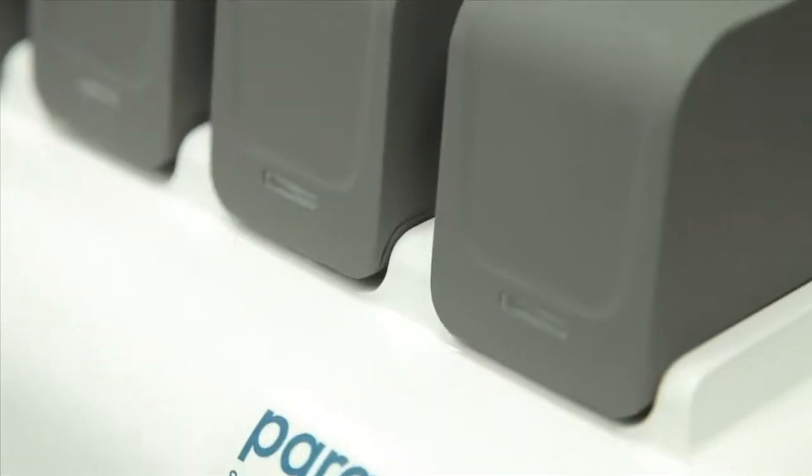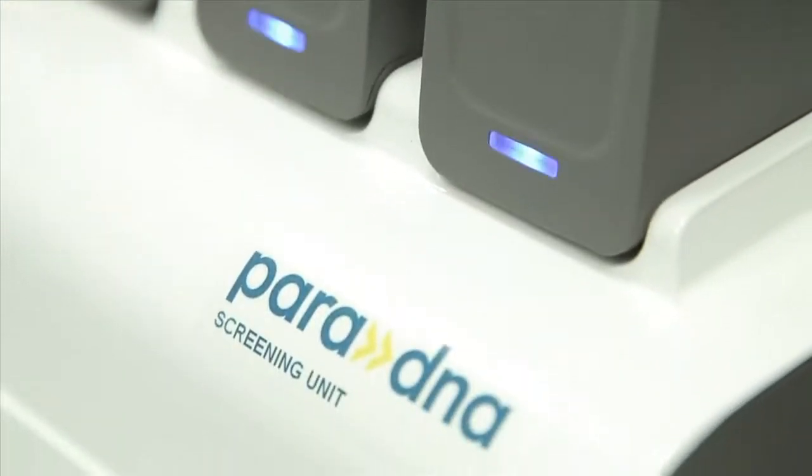ParaDNA includes two new instruments to detect DNA. We're only demonstrating the screening unit, which will be located in the police submissions area.